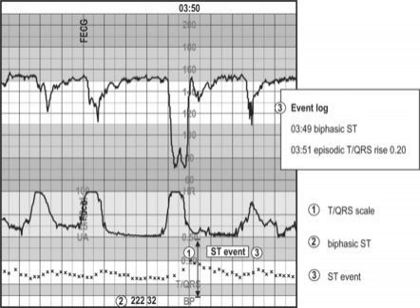In any case, in the 9 months of their study, they had 3,580 deliveries, and 1,221, or 34%, had a scalp clip placed for any reason, which seems awfully high, at least to modern standards.